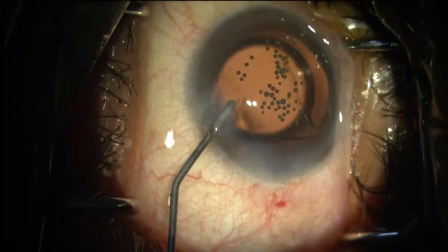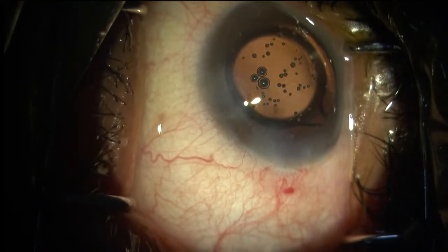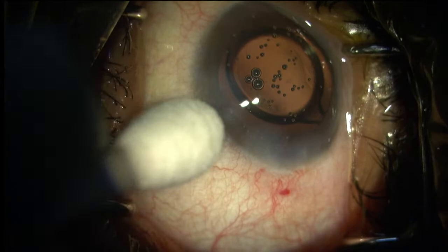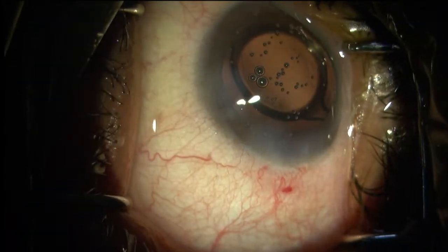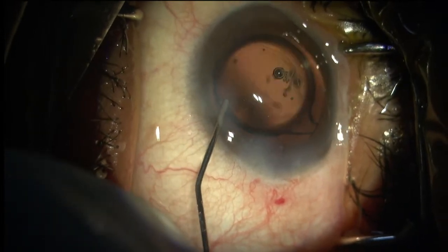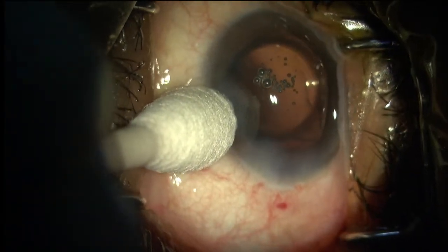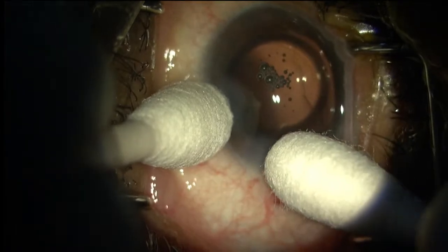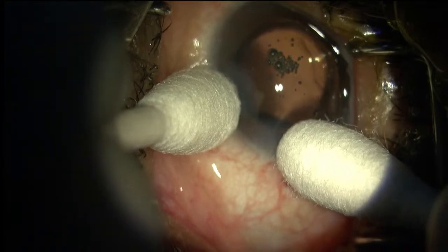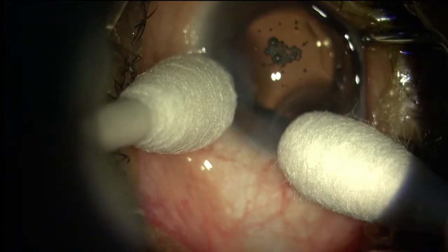So that will always depend. Two swab sticks to press the wound. I always press the wound and check once more. If you see the wound is leaking by any chance, then instead of keeping on hydrating, keep it pressed for 30-40 seconds, it will seal. Because now the tunnel will get compressed, and count up to 100 or so, and it will get sealed. Many people keep on hydrating there, and you should leave no wound leaking.